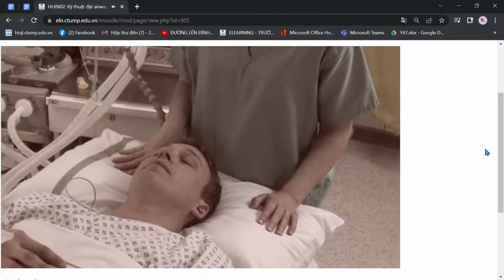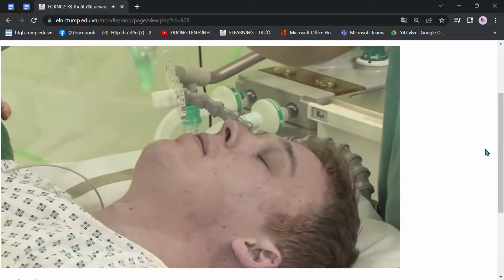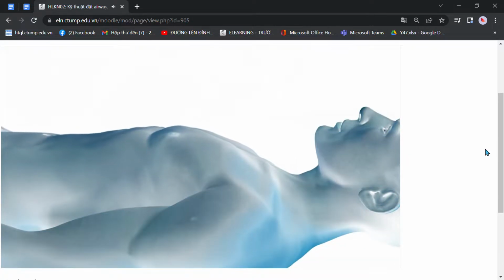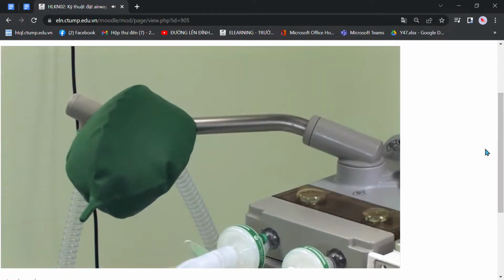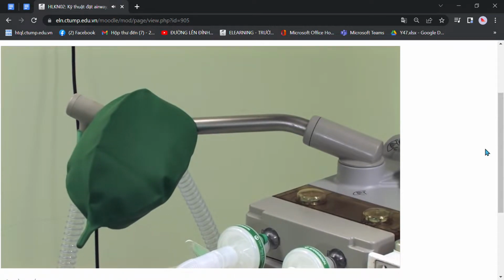Clinical signs of an obstructed airway include noisy breathing, increased cyanosis, seesaw movement of the abdomen and chest, and indrawing of the supraclavicular, suprasternal and intercostal spaces during obstructed inspiration. Additionally, there can be seen a reduction in the movement of the reservoir bag of the anaesthetic breathing system.